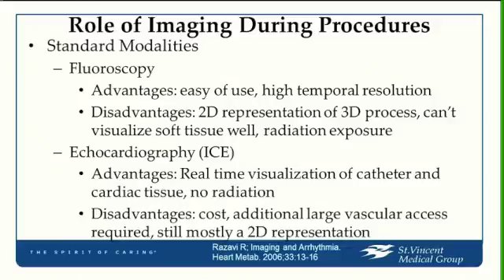So as Dr. Lack already said, there are many toys that we have. But if you go back to it, the most common method we use is fluoroscopy, fluoro. It's what we're all trained on. It's easy. You step on the pedal, you see the X-ray image. It has high temporal resolution. You could set the frame rate, but it's got some significant disadvantages.